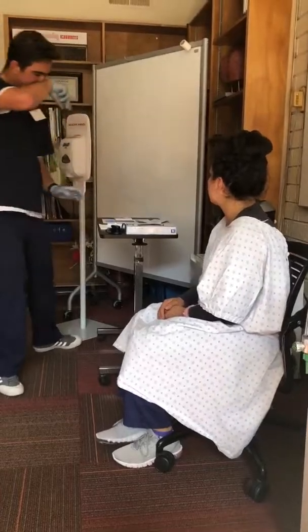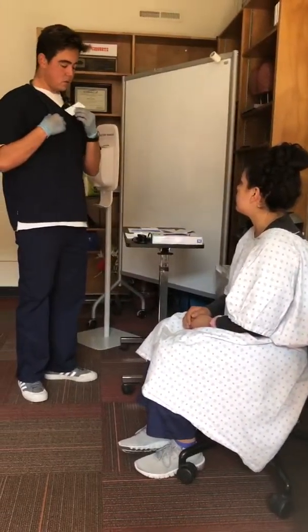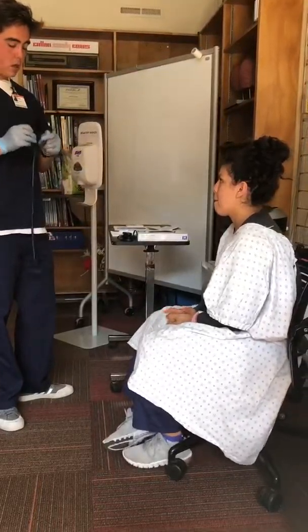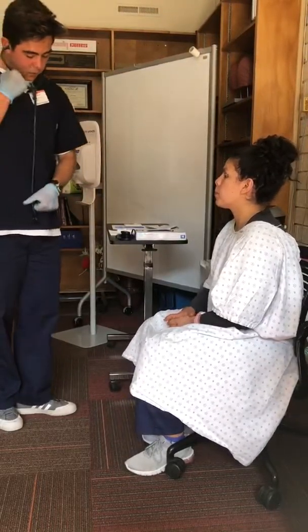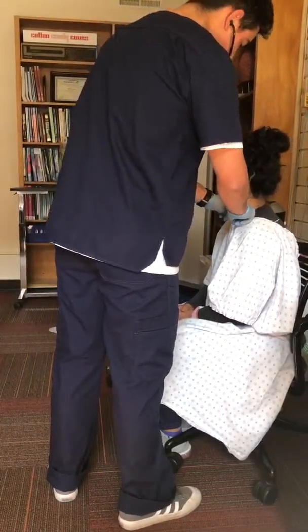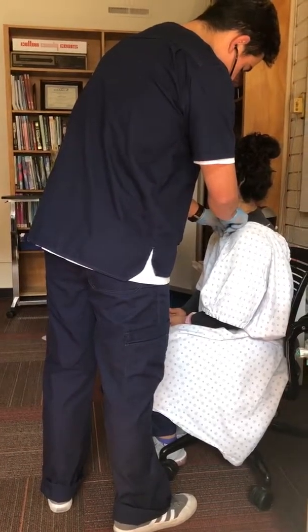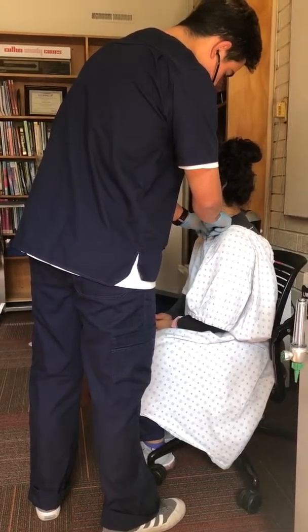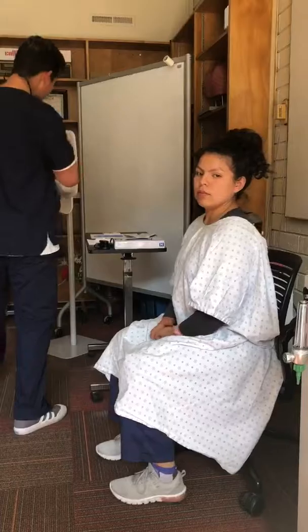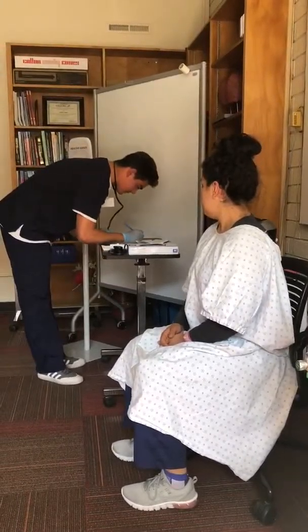Okay, so we're gonna go ahead and we're gonna reassess your heart sound as well as your lung sounds, okay? Okay. We're gonna start with those heart sounds. Again, bell of the stethoscope to skin for a better sound. Thank you. And noting S1, S2, good rate, rhythm, and quality.